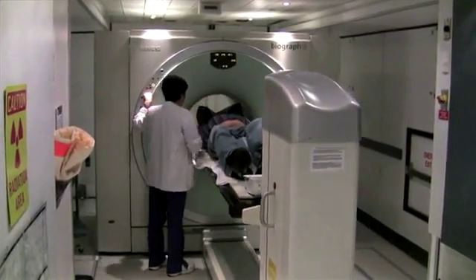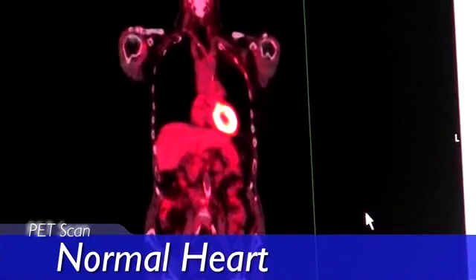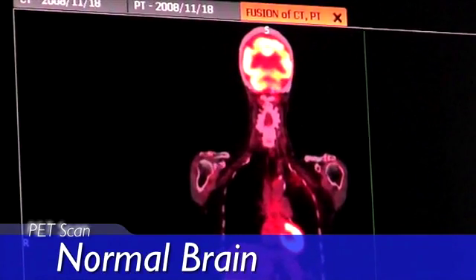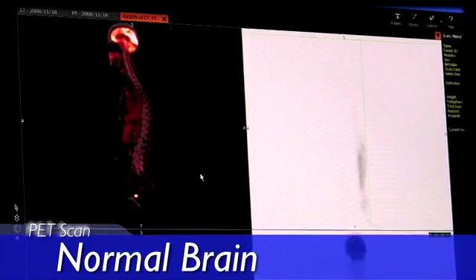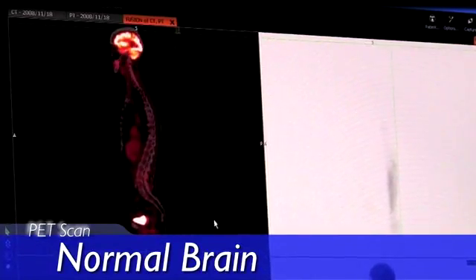You can infer from that there are some tissues of the body that would normally show up very bright on a PET scan. The heart is always using a lot of glucose as it beats, so the heart always shows on the PET scan. And in fact, variations of PET scan in real specific ways can actually be used to evaluate the heart. That, of course, is not why I use them. The brain always takes up a lot of glucose. Variations on the way that PET scans can be used are sometimes used for in-depth analysis of brain activity and various aspects of brain function. But the brain itself is not easily examined for malignancy by the PET scan because of the glucose activity there.